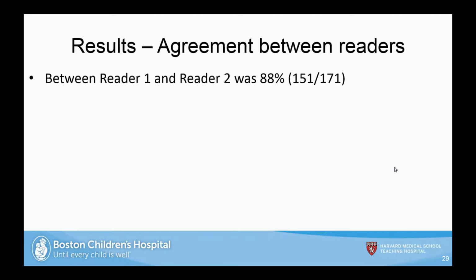Yeah. So the slide says this is what the reader said was a diagnostic image. Right. But are they running this twice, once for each reader? How do you resolve the discrepancies between readers for training the model? Yeah, they do this agreement between readers assessment. But when you're running through your training set, you need to know the truth. What's the truth?